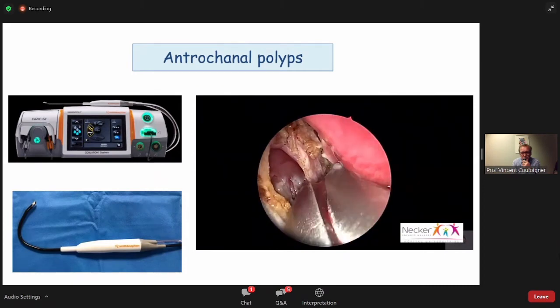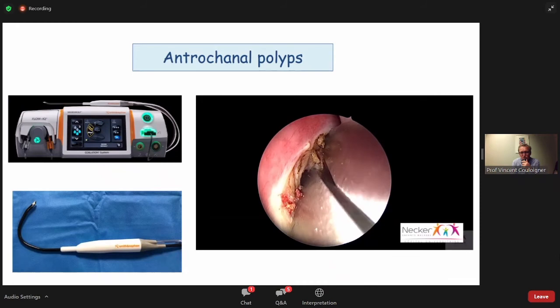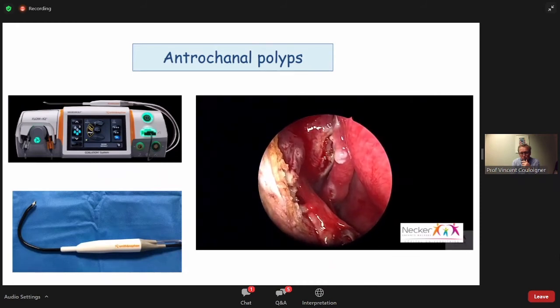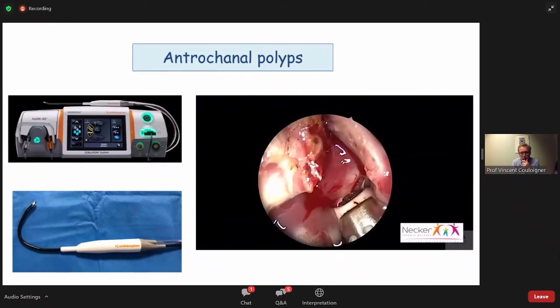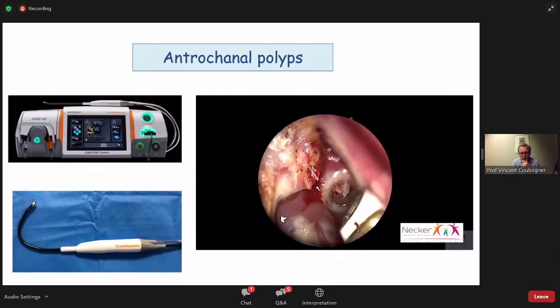And as was previously mentioned, of course, it is absolutely critical that the shaft is not obstructed. So you have to wash it regularly. And again, this halo system has a stilet, which is rather useful to avoid obstruction of the shaft.